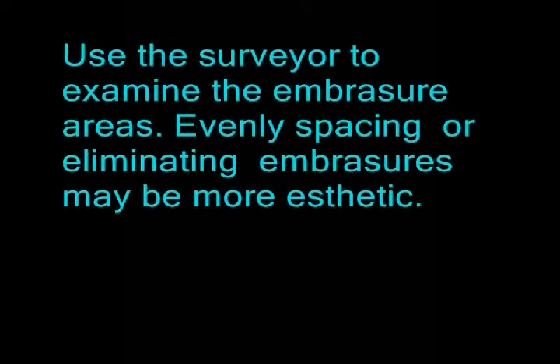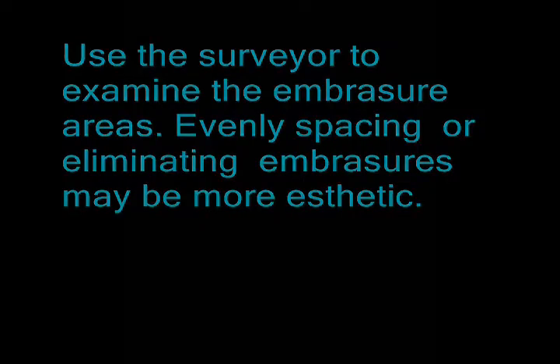Finally, the partial denture should be examined for aesthetic effects. Embrasure spaces should be eliminated or evenly spaced when possible to provide a more aesthetic result. Spaces may be eliminated, reduced or modified by tilting the cast. Alternatively, spaces may be eliminated by tooth preparation.